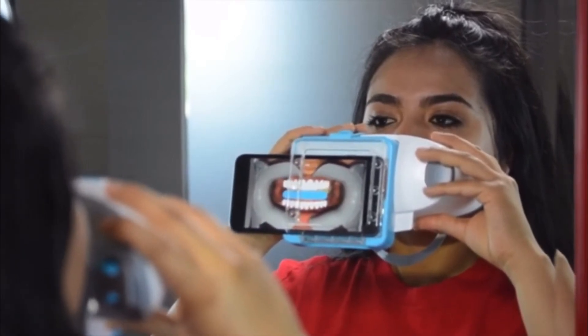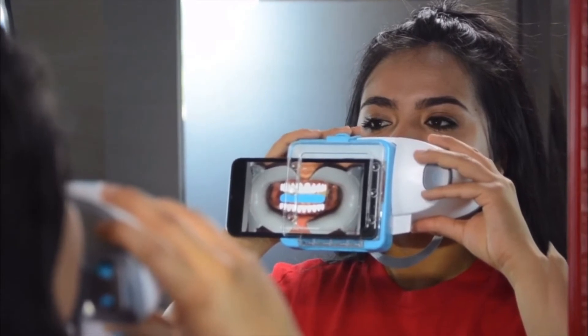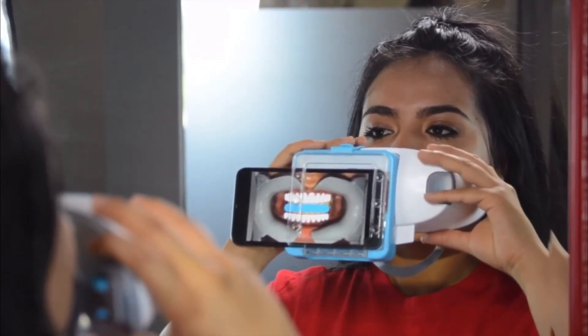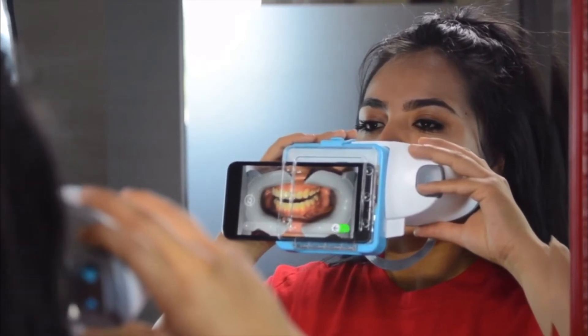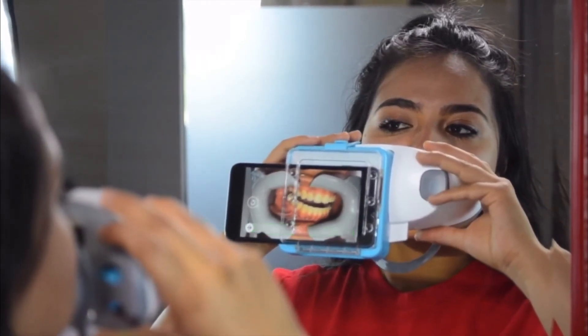For this next step, you'll have to keep your teeth slightly apart and scan side to side. Double tap to continue. Open your mouth slightly and keep your teeth apart. Shift the scan box to one side. Now shift the scan box to the other side. Back to the center.